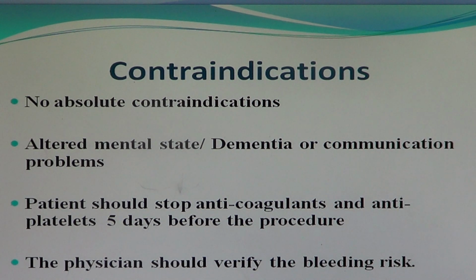Contraindications. There are no absolute contraindications, but according to some literature, altered mental status, dementia, or communication problems. Patients should stop anticoagulants and antiplatelets 5 days before the procedure.